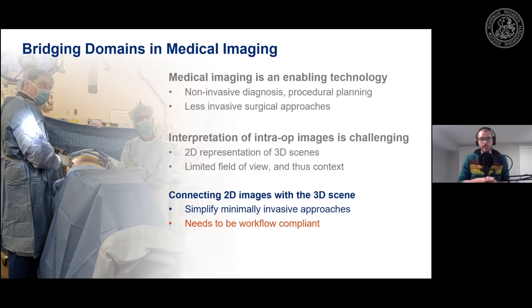So really what we would like to do is use strong, novel computer vision paradigms and machine learning techniques in order to develop systems that allow us to improve context, improve the understanding of the scene in this talk via means of 2D and 3D alignment and alignment of these spaces to guide navigation and improve the assessment of these images in surgical tasks.